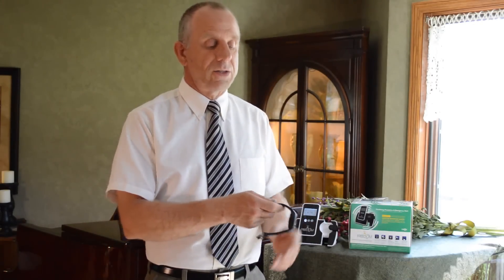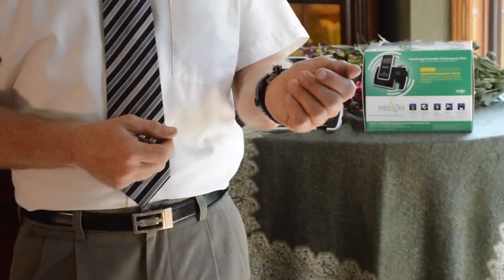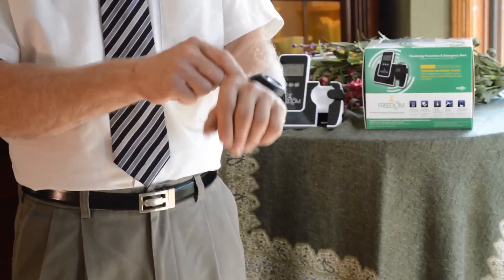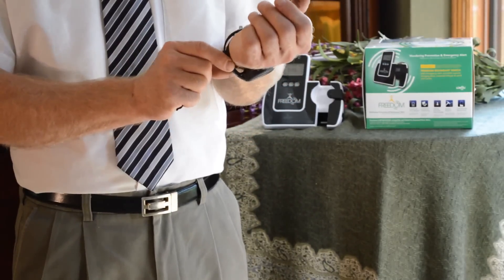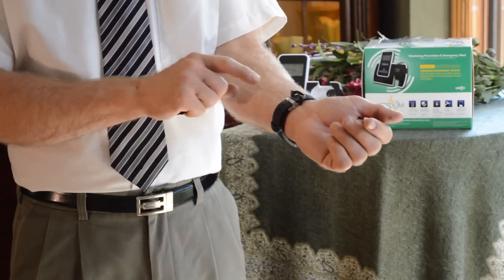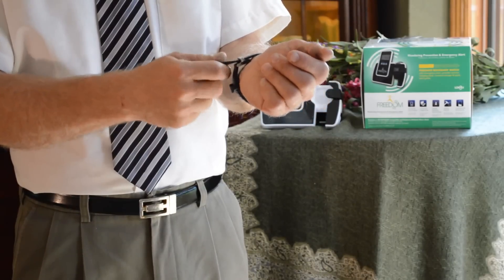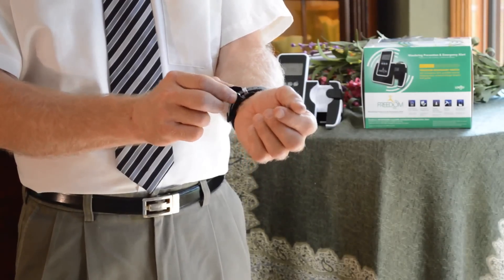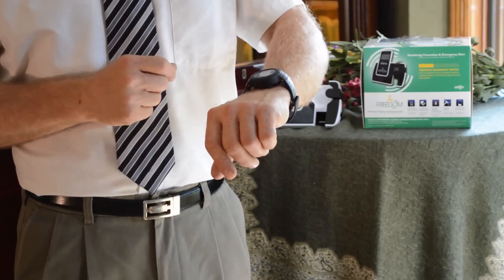We'll now put the watch on and take it into an emergency alert situation. We've got the watch on and we're going to show you the locking mechanism. Once it's on and fairly snug — this is a hypoallergenic wristband that won't irritate the skin or cause any skin tears — we press this down to lock it. You'll hear a little click. Now we cannot take this watch off. To release it, we need a special tool. We can keep it on 24-7 if necessary.